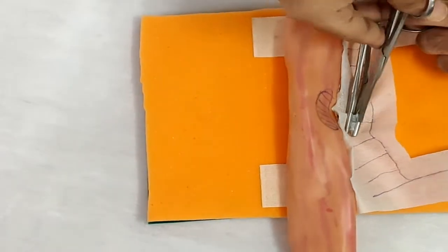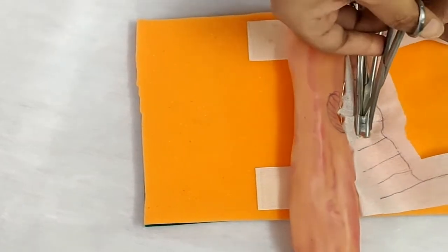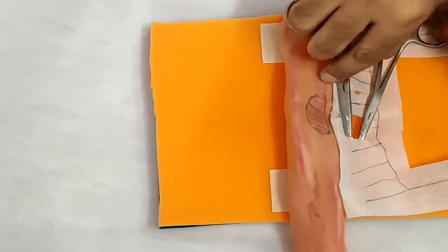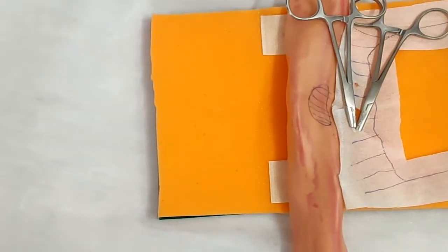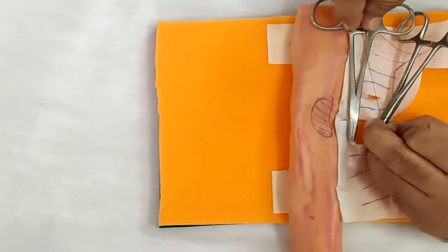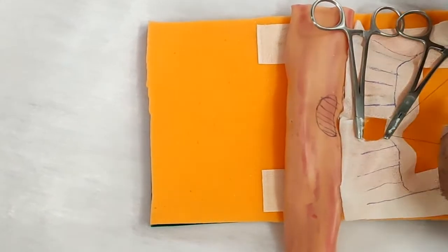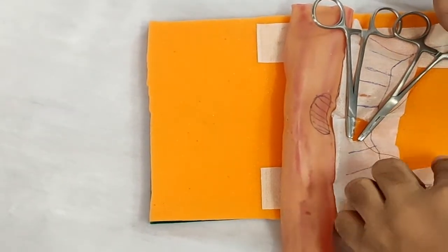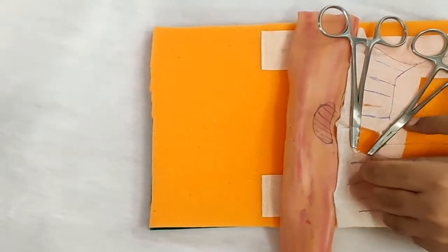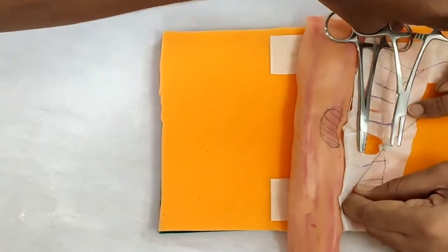Now we will cut the segment. The ends need to be tied with a surgical suture so that hemostasis is achieved and bleeding is controlled. The assistant will remove the artery forceps so that we get a good approximation.